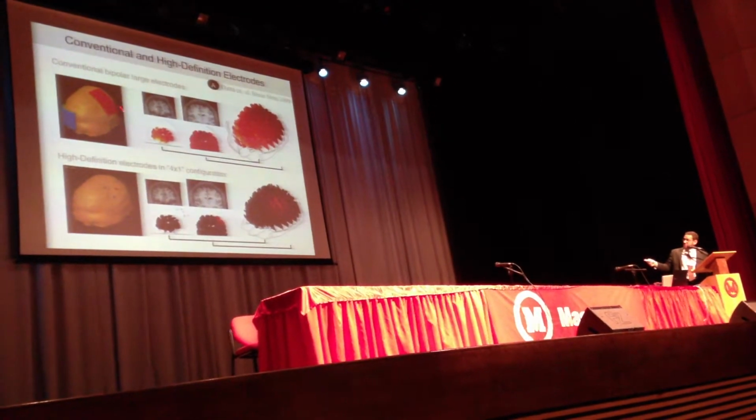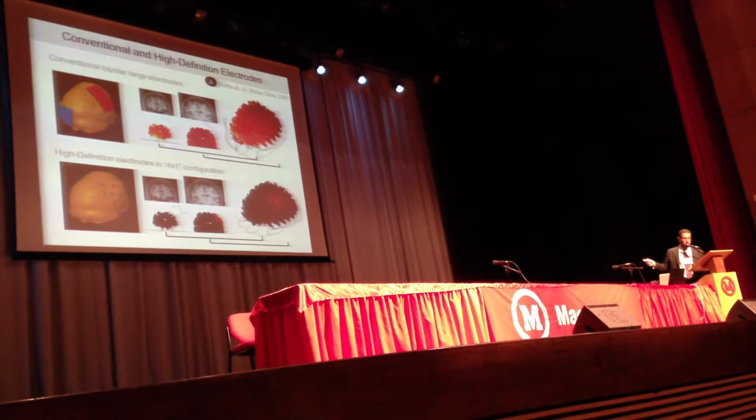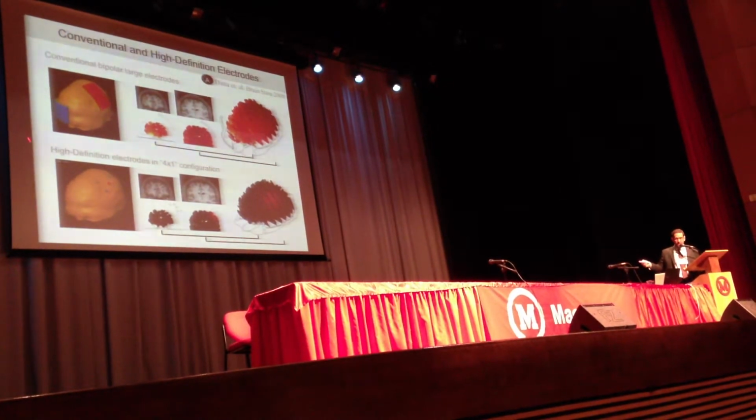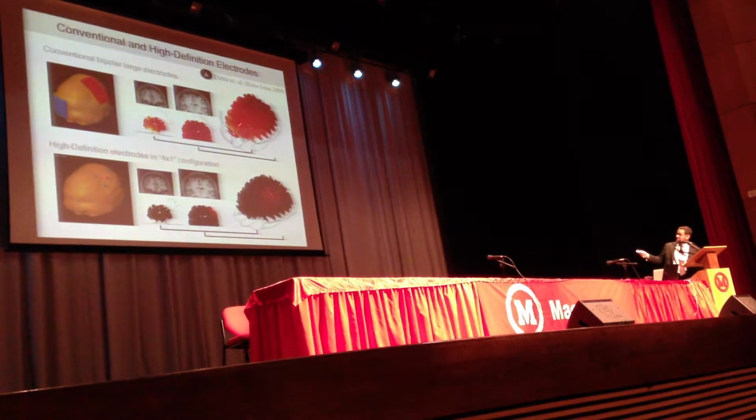It's not going to just enter here and disappear, and then reappear here, right? So it has to flow all the way across. And this idea is what you see in the model. You see the current is actually flowing all the way across the head.